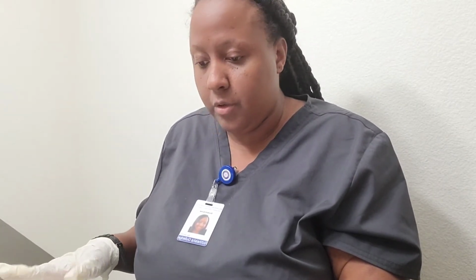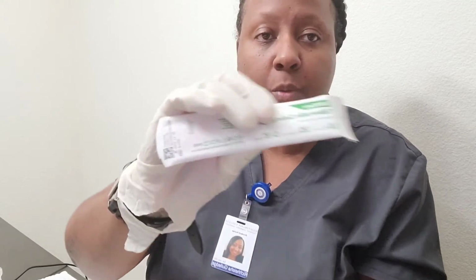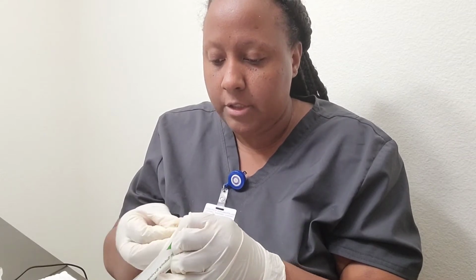Okay, so I am going to go ahead and open up my syringe. And again, this is a 1 milliliter 25 gauge syringe.